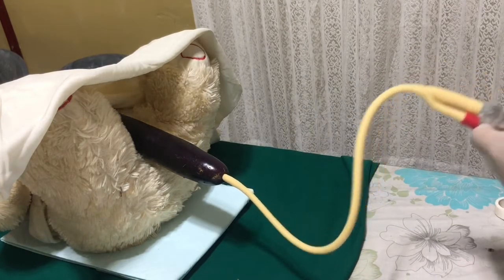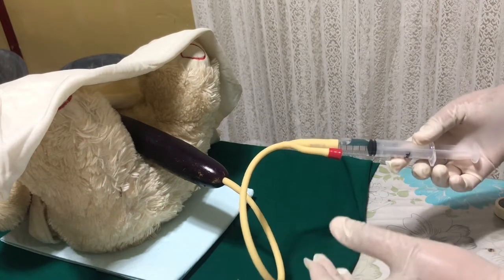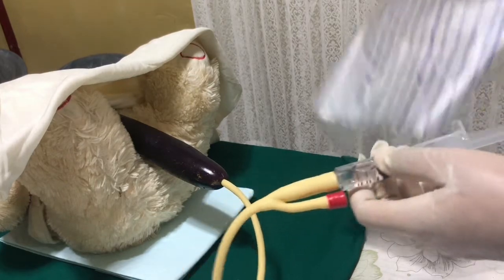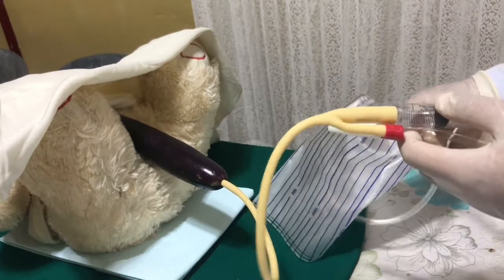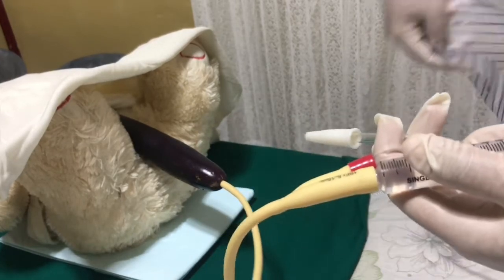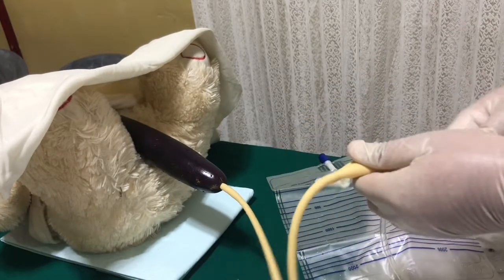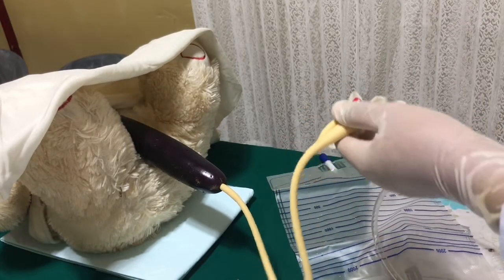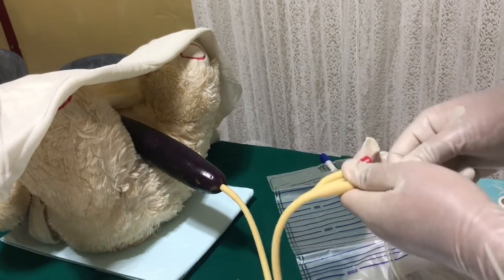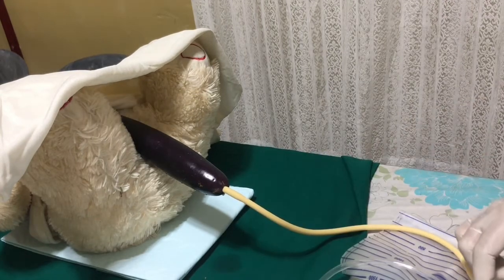Do aftercare of other equipment used. Attach the catheter to the urine bag below the level of the bladder. Tape the catheter to the lower abdominal area.